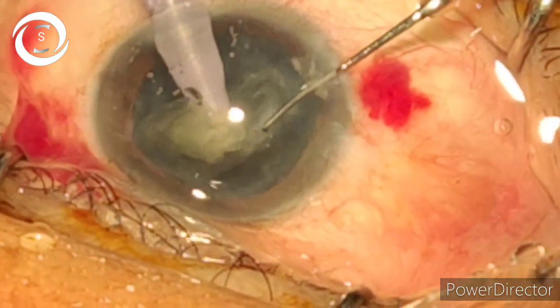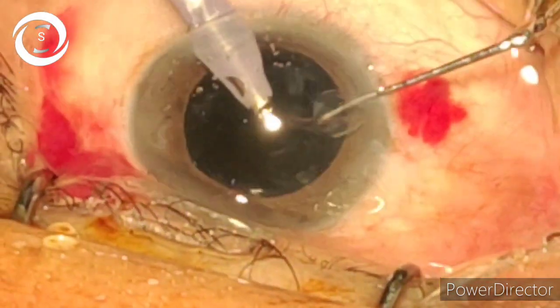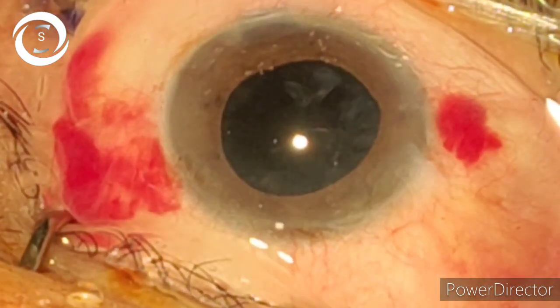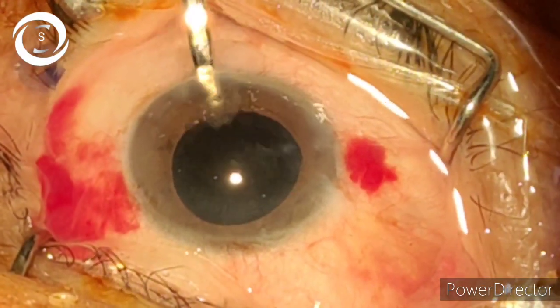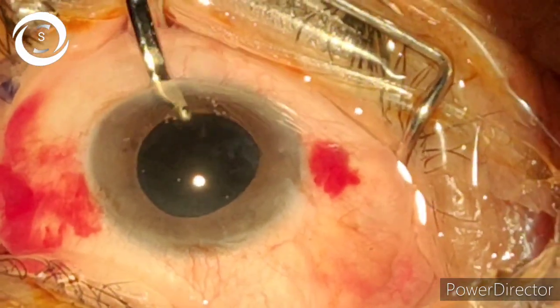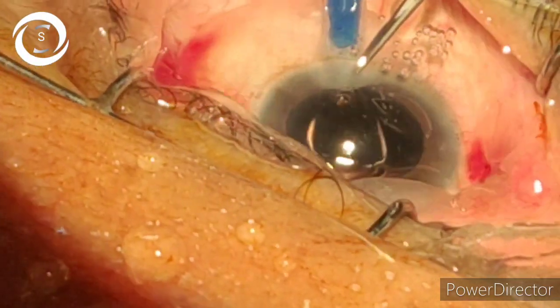Critics say that as you do phaco a little bit anteriorly, there is an increased chance of damage to the cornea and corneal decompensation can occur. Well, I have been doing phaco with this technique for the last four years and I have not encountered a single case of bullous keratopathy, because when you divide the nucleus into many pieces, within a blink of a second in phaco mode you emulsify all the pieces. You can also use a good viscoelastic to protect the cornea. The cornea is more resilient compared to the risk of PCR.